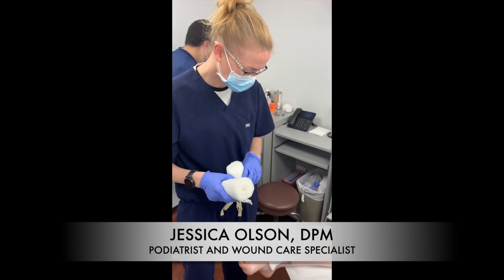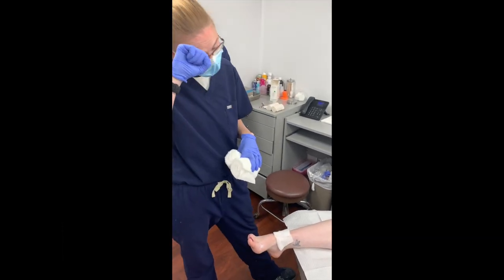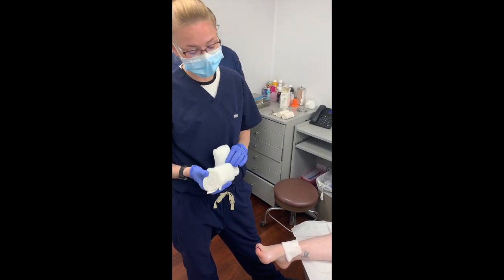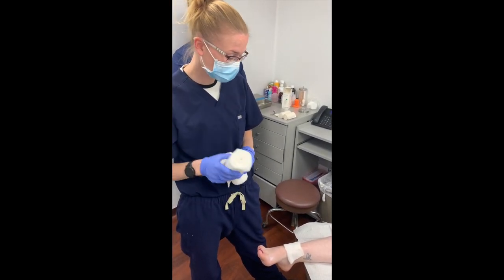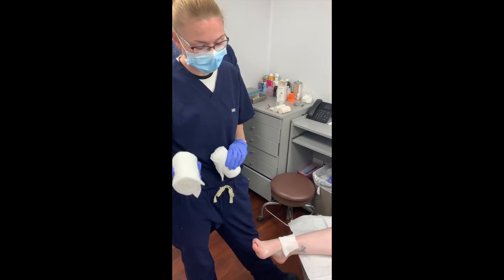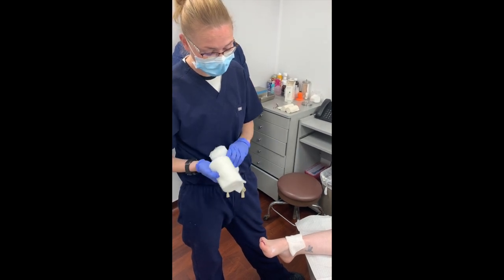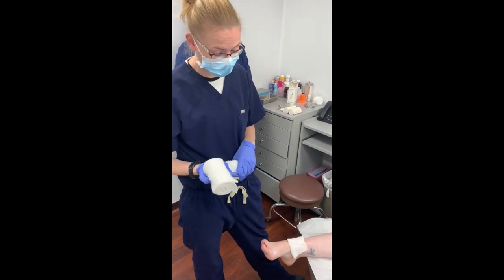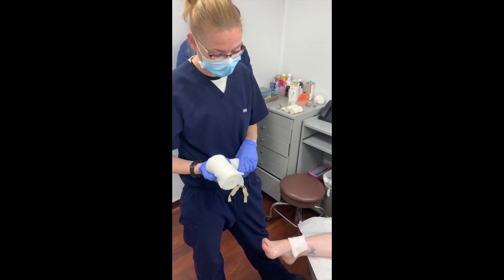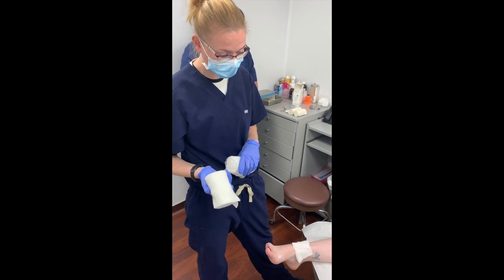We just covered how to do an unna boot for compression therapy. Sometimes unna boots are not indicated and you need to do a different type of compression therapy. This is a different version — it's a three-layer compression with ace bandages. You could also do a three-layer with a co-band, or a four-layer compression. It's all dependent on your patient — you want to make it patient-specific, and included in that is their diagnosis and what's most appropriate for their treatment protocol.